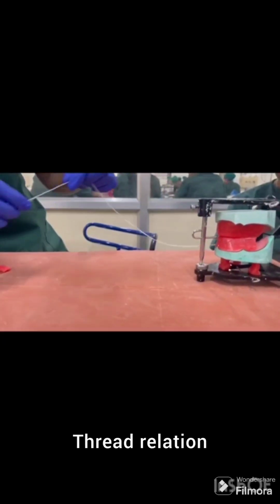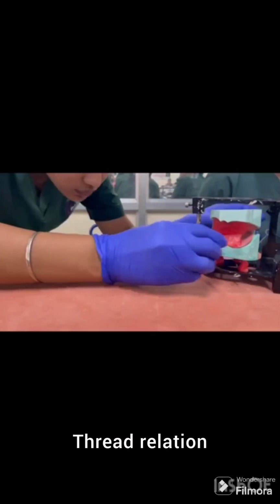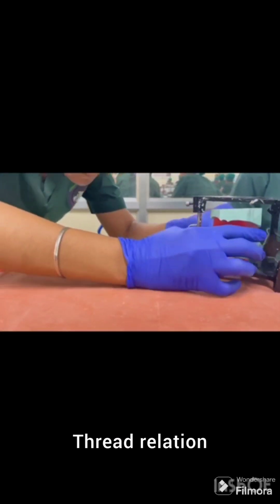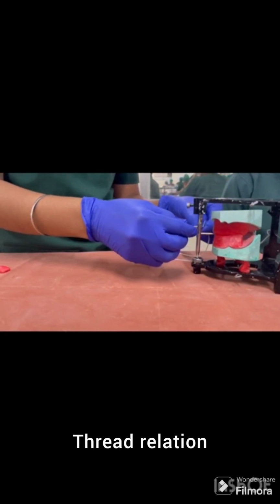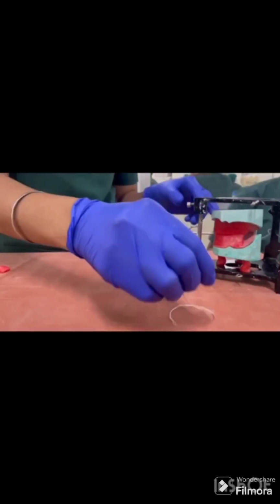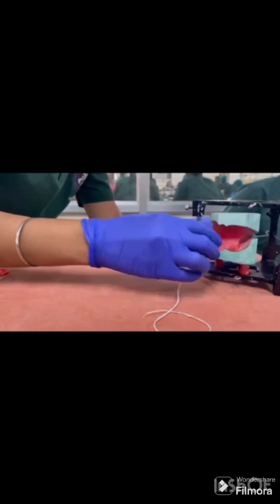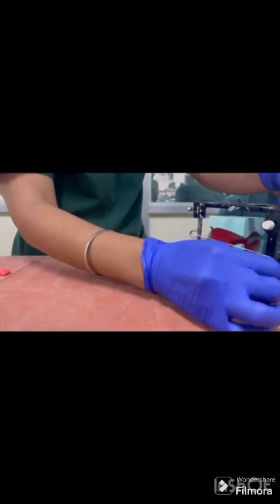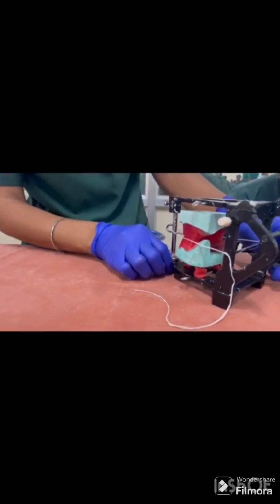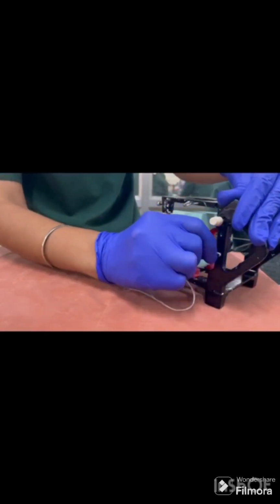A thread is suspended all around the articulator, running anteriorly across the mid-incisal pin to the point where the posterior horizontal pin meets the vertical rod. Wax blocks are stabilized on the lower member, one anteriorly and 2 posteriorly, and the occlusal rims with cast are placed over the wax blocks. The height of the wax is reduced or increased as required, such that the reference plane of the thread coincides with the occlusal plane and the incisal pin meets the incisal table.